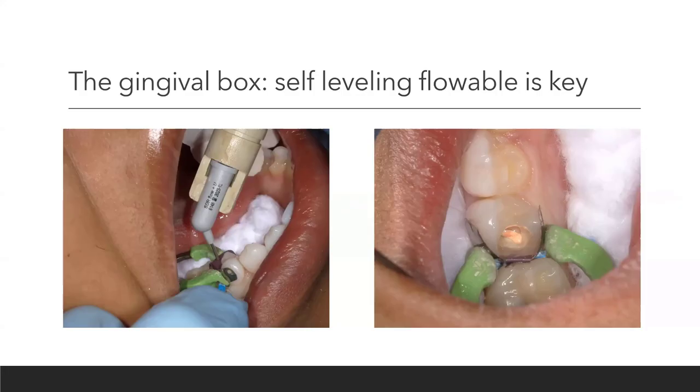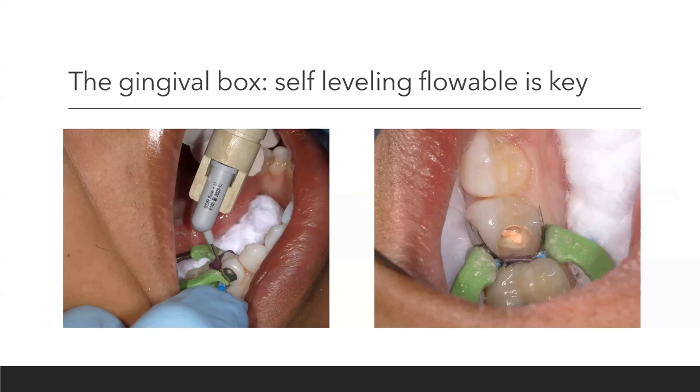I have always believed in self-leveling flowables for the gingival box. I'm going to show you SDR Flow Plus — I've been using this product since it launched. Inject it along the gingival margin, wait about five seconds and let it self-level. There are other great products: Extra Base from Voco, bulk fill from Shofu — these are all self-leveling flowables. Self-leveling flowable means it's going to level and flow. I want to make sure my gingival margin is fully covered. These are often bulk fill, so you can go up to four millimeters, but routinely in this case it's one millimeter max.